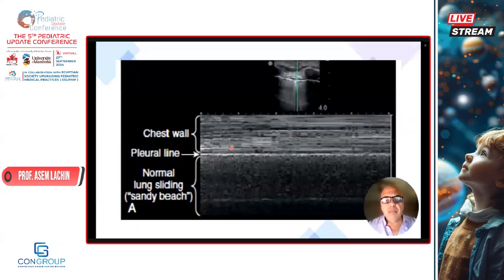Here we can see the M mode of the lung ultrasound, showing this part is the chest wall, including the subcutaneous muscles, the ribs, and others with limited movement. And this is the pleural line, which is a white horizontal line here. And here is the normal lung sliding, and each movable or sliding tissue will appear in the M mode as continuous dots, or the sandy beach sign. So the sandy beach sign is a normal lung sliding picture. You can find the lung tissue, as we can see here, in multiple dots.